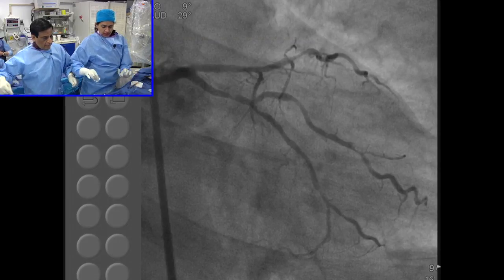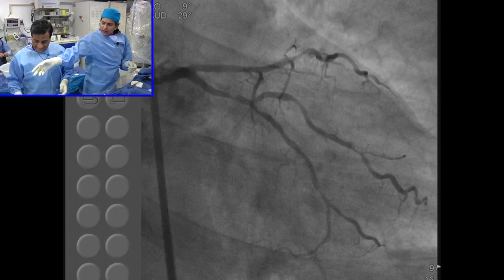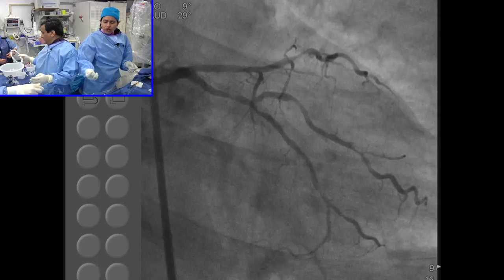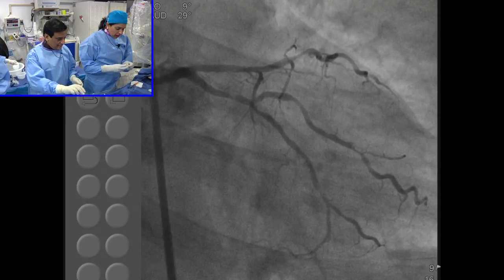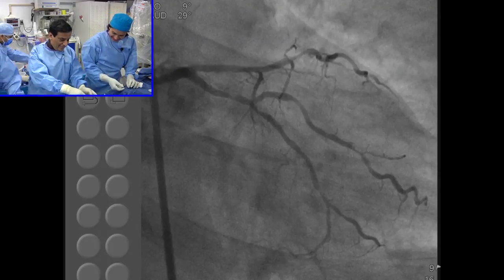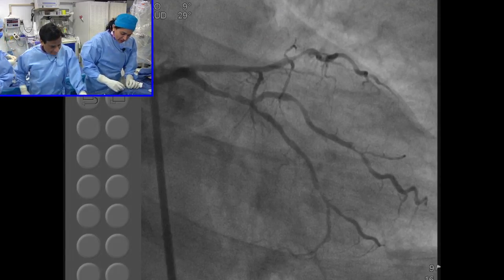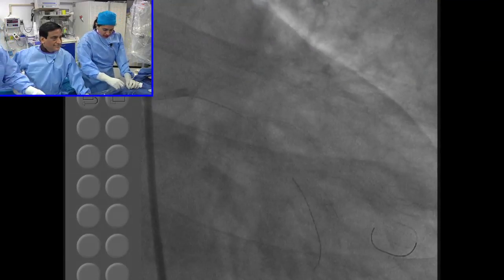So Samin, has somebody conducted research as to why it's called chocolate balloon? Yeah, I did ask them that question. I don't know what answer I got. All right. What was the reason for calling it chocolate? I think those nitinol cage, they look like a chocolate bar. All right. Maybe I just made it up. Well, a very funny name. As good an explanation as even the company would have. Maybe it is not. You see how the nitinol bar is, it looks like a Hershey chocolate bar. You have to pull the wire.